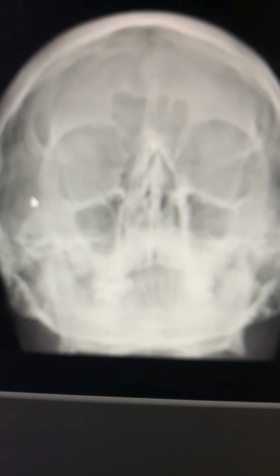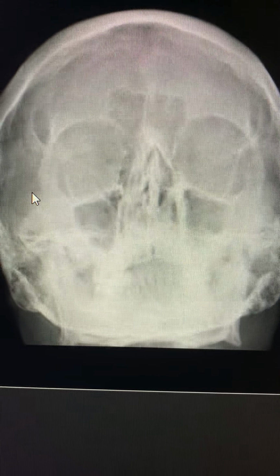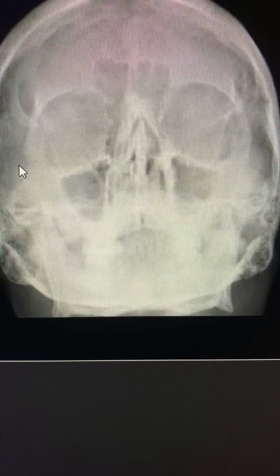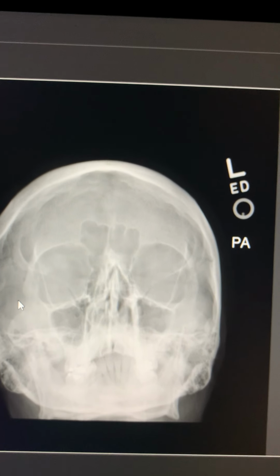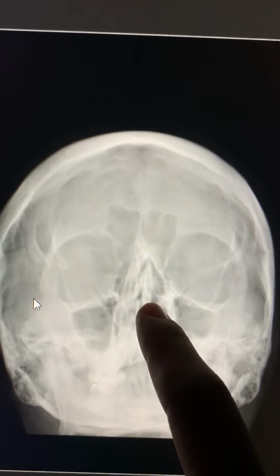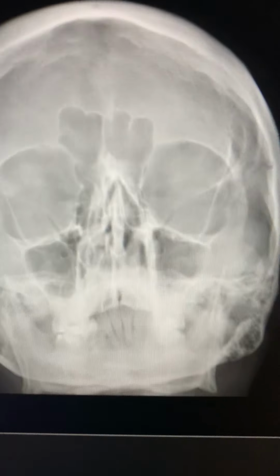The patient was shielded with a waist band of lead, to make sure that we are ALARA compliant. And this I would honestly probably even tilt the patient right just a little bit. Here is the slight deviation that the radiologist found. It does deviate to the left just slightly.